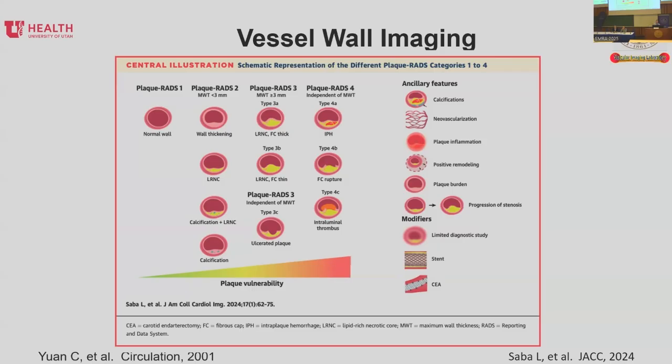And also it's intended to grade the system with a number to say, you may have a high-risk plaque and you may have a stable plaque or whatever that is. And I think that this actually is an accumulation of many work by many experts or research people in this field to get to this point.